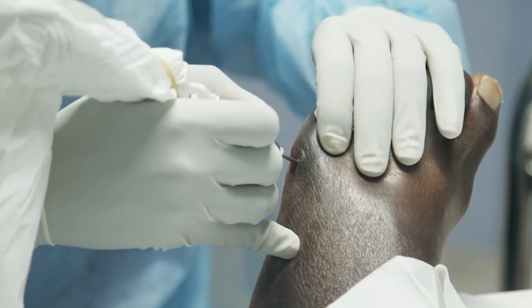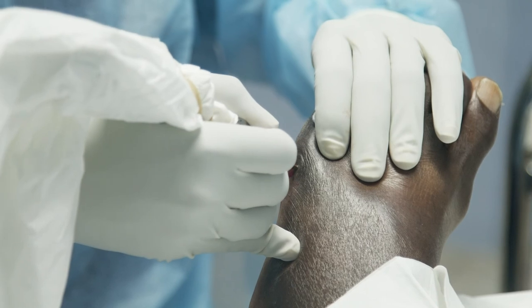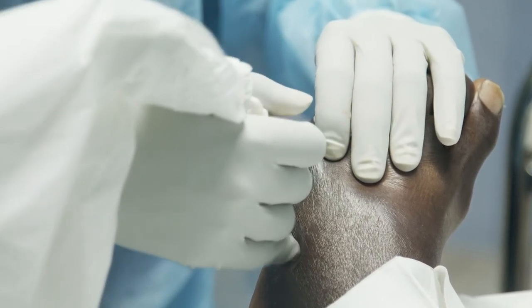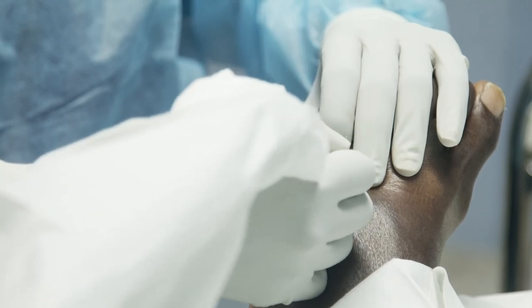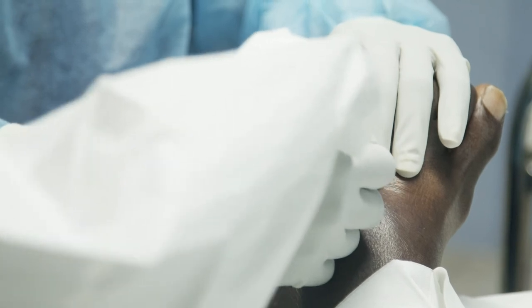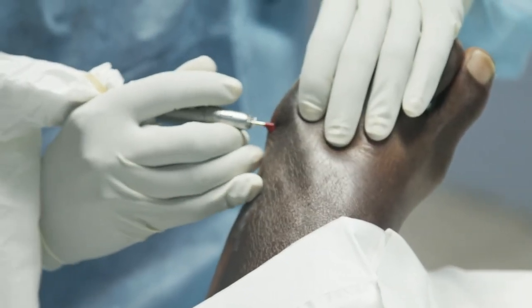Okay, and so we're coming right through the bottom of the bone, still in the joint capsule. You hear that sound now? Right in the joint capsule. And this will just click when I get through, and I can see the change in the met head already. And we're through. So now I just want to go to the top.